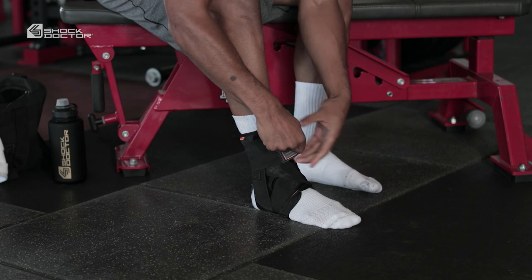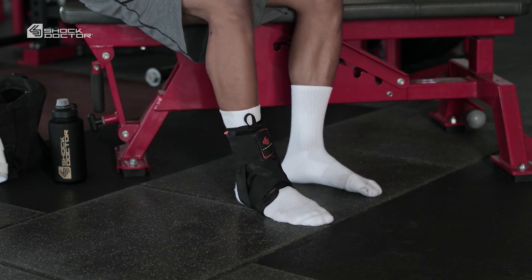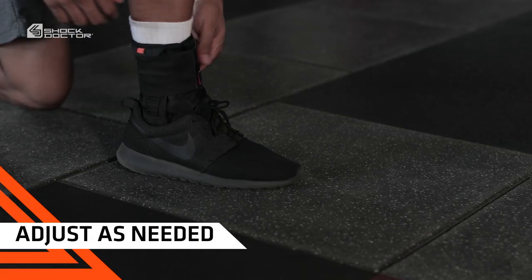The brace should feel very secure and comfortable. If it feels too tight or binding, make further adjustments. During extended use, we recommend rechecking position and tension and adjust as needed.